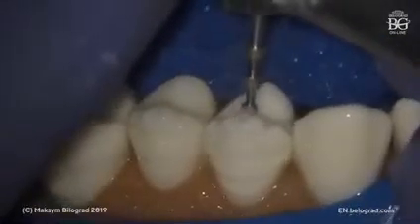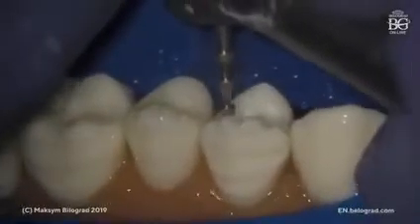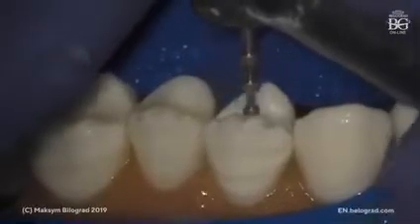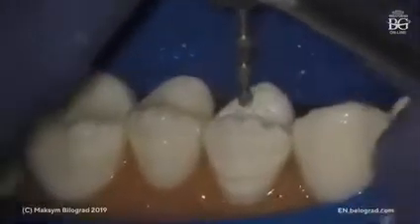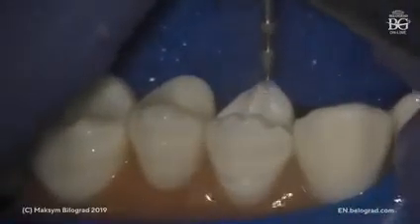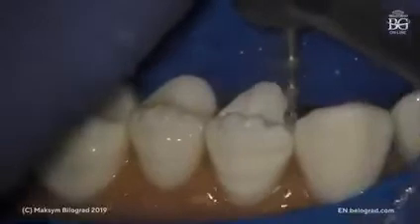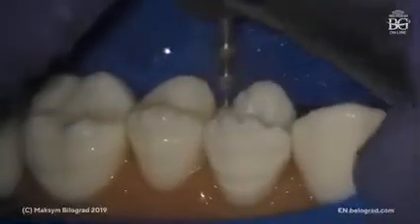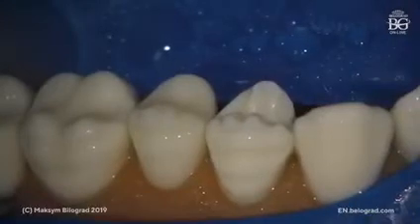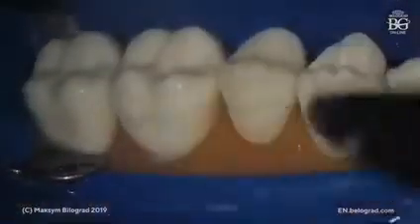and also we prep occlusal surface. We prep inside fissure and palatal cusp as well. Okay, so that will be full occlusal coverage. Once you make this type of preparations, you made these grooves, we have to mark everything with pencil or with marker. We have to mark these grooves, these lines.